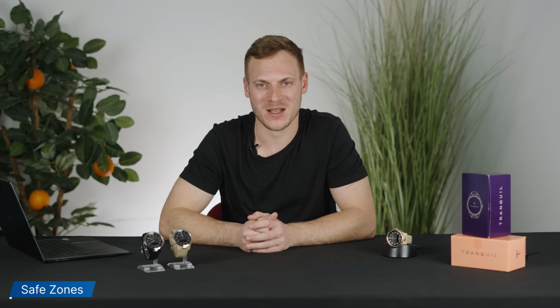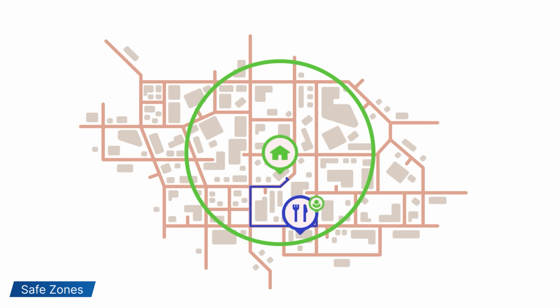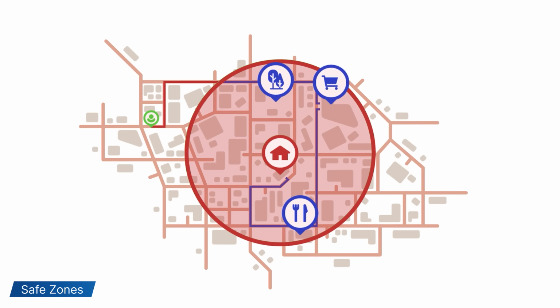So let's talk about safe zones and home exit alerts. So safe zones, sometimes known as geofences, allow you to be alerted when the wearer leaves or enters a certain area. Now, safe zones are normally a minimum of around 600 feet, and they are useful particularly if somebody has dementia and they're at risk of going wandering. You can be alerted when they've left that area, perhaps around their house or their neighbourhood, and you can make sure that they are safe. This means you don't have to constantly just be checking the app to make sure they are where they're supposed to be. You can just wait and relax and know that you will get an alert when they've left that area.